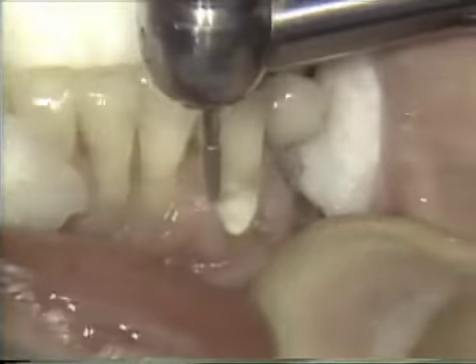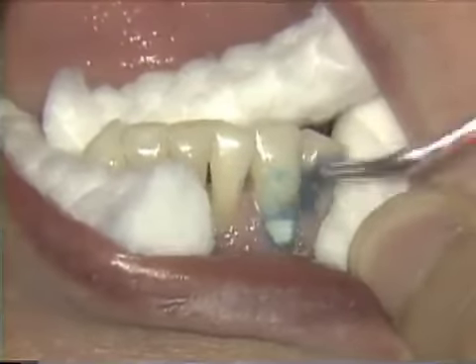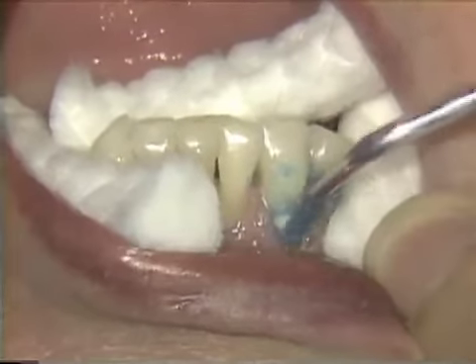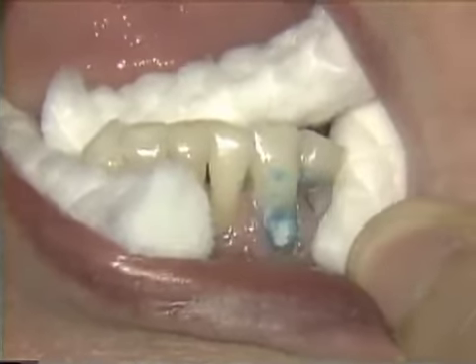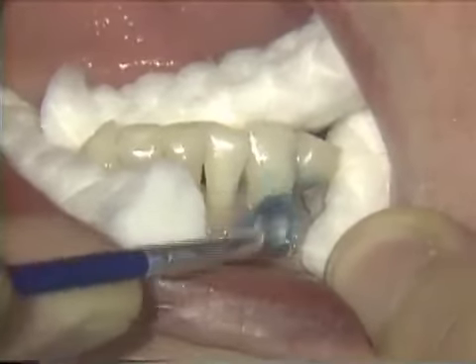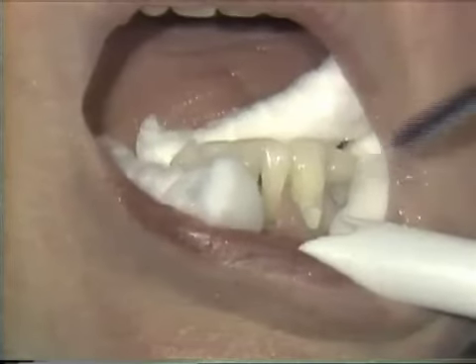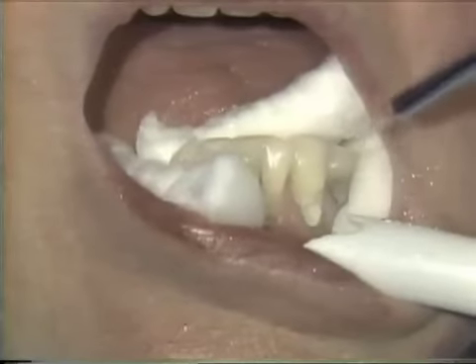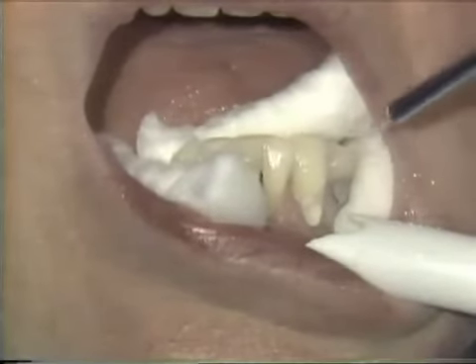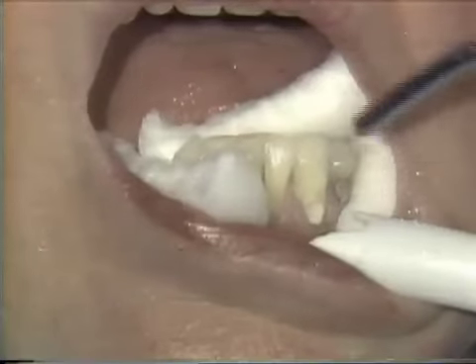When a glass ionomer is not used, a dentinal bonding agent is applied before and after beveling enamel to protect the dentin from the acid. No etchant gel is applied to either dentin or cementum unprotected by either glass ionomer or a dentinal bonding agent. The tooth is thoroughly rinsed and quickly dried. Remember, over-drying the tooth at this point before the bonding agent is applied will result in cracking of the glass ionomer.